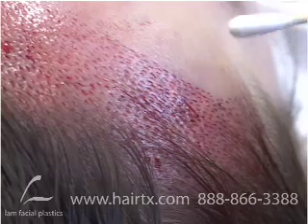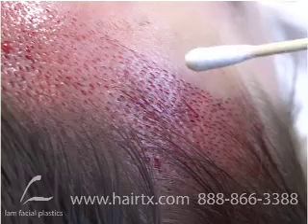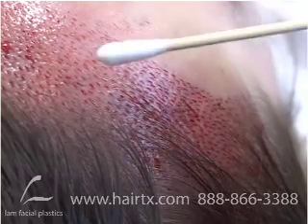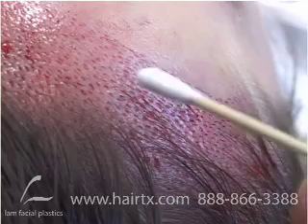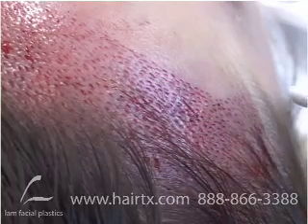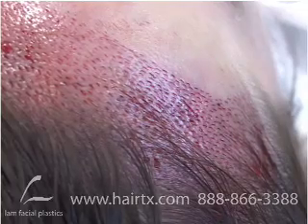It's interesting, the female hairline is exactly the opposite of what happens in a male hairline. About 95% of male hairlines move anteriorly. These all go posteriorly. The sides are actually angled this way. It's hard to see because they just look like little tiny holes, but they're going back in this direction. So they're sweeping back and then sweeping down anteriorly. And this is going to be different from the left side. Let's go take a look at the other side.